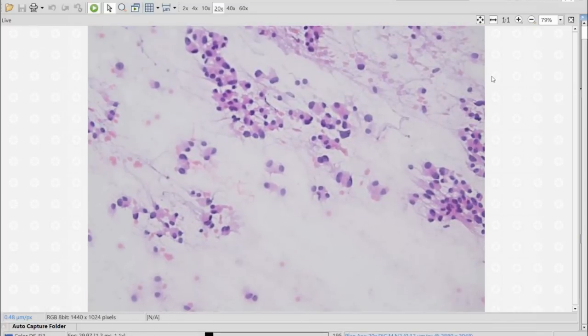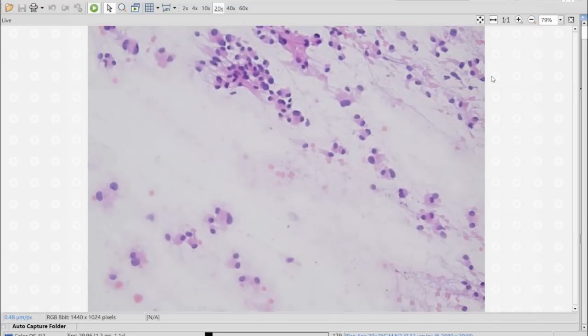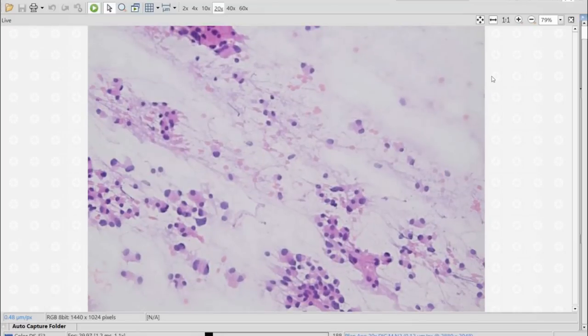They are glial tumors. So some of the cytologic features are those of a glial tumor, but they tend to have some processes, eosinophilic cytoplasm, but not to the extent that you will see, for example, with an astrocytoma. Okay, so they look a little bit more epithelioid. They have this hybrid nature of epithelioid features, but also glial features, and that's something that is reflected in the smears.